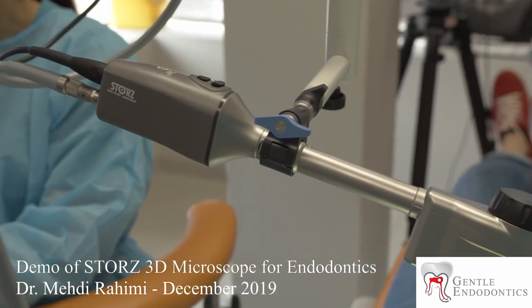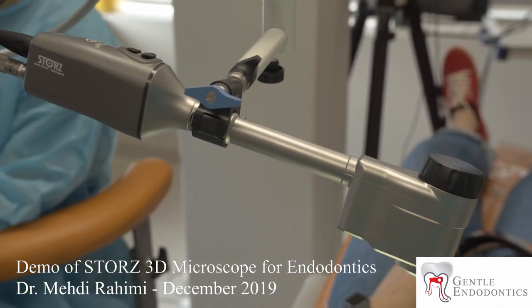Give me a shorter ET25. Yep. The shorter's there? Yeah, shorter ET25. You might have to go and get it.